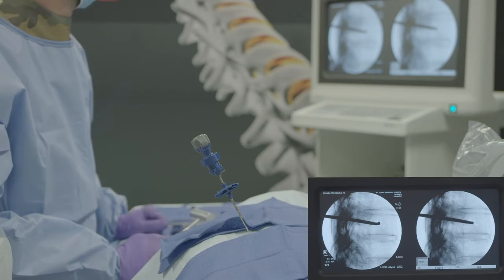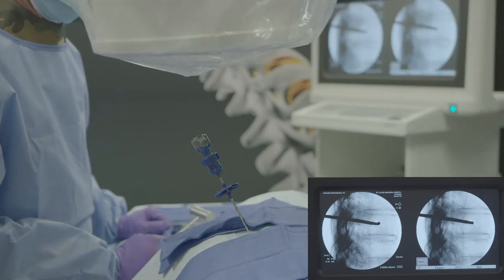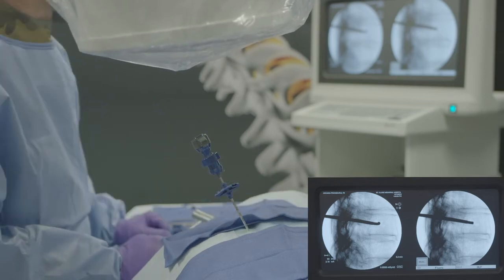Verify in the AP view that the distal tip of the power curve navigating osteotome is across midline at least to medial border of the contralateral pedicle.